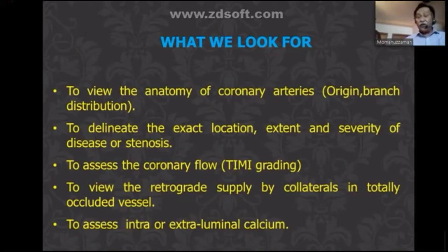from a therapeutic point of view, because diagnosis is not all you need. You also need to guide the therapeutic intervention. So nowadays, we are getting a lot of CTO patients. If you don't see the retrograde collateral, we cannot plan what to do for them. And also assess the intra- or extraluminal calcification.